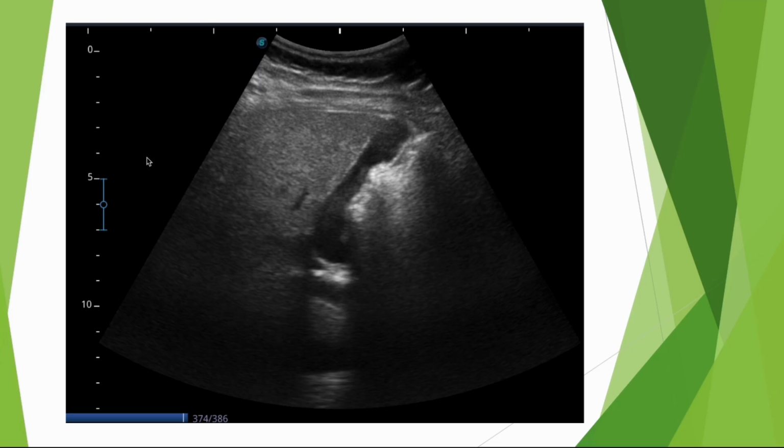As you can see here, of course, we have the top and bottom of the patient, meaning the head and the feet, with the liver here, and here is our gallbladder, which is present right here. What immediately stands out are these two highly echogenic images seen in the gallbladder. The first thing that comes to mind, obviously, is the presence of lithiasis.